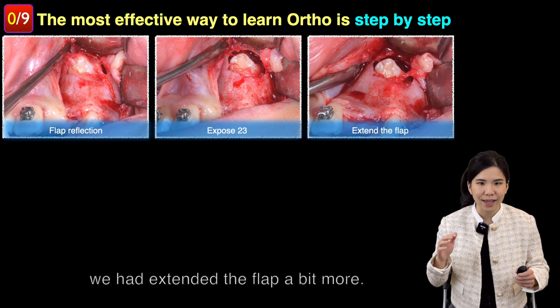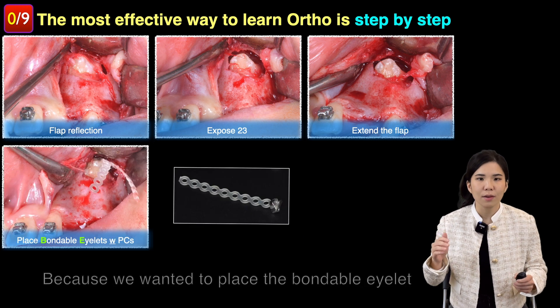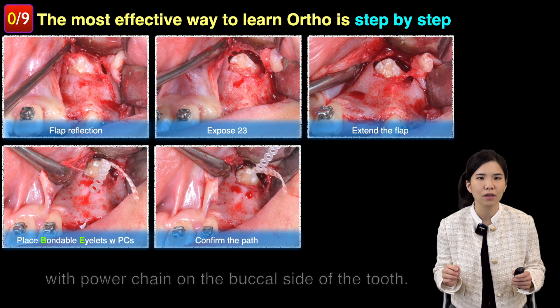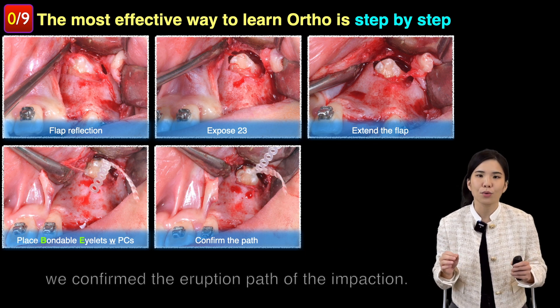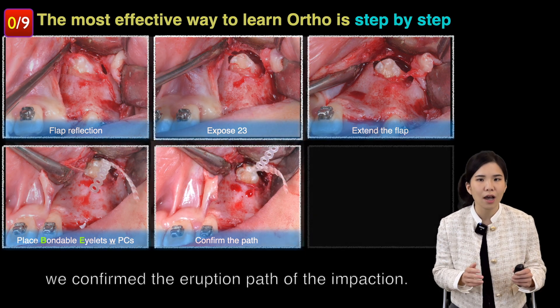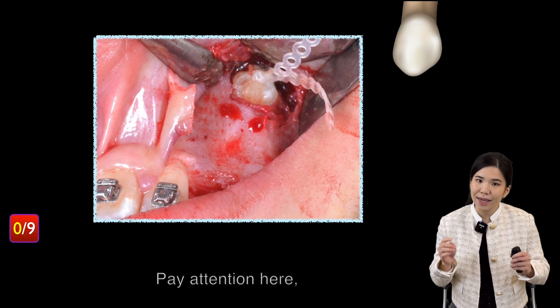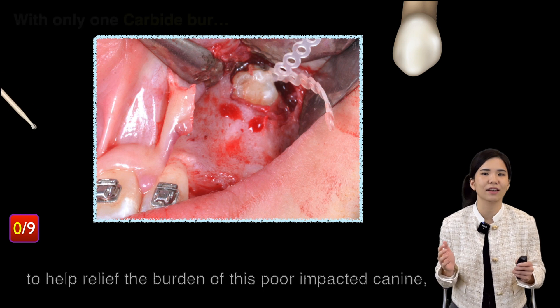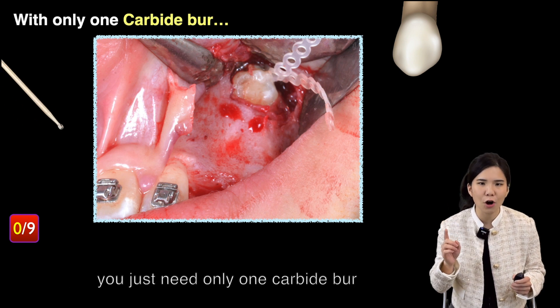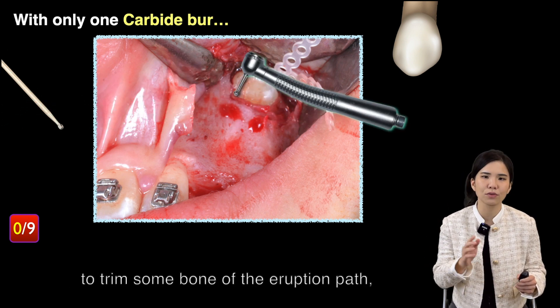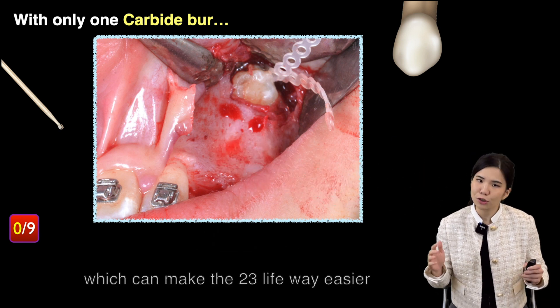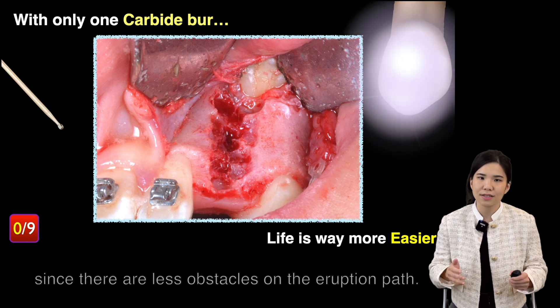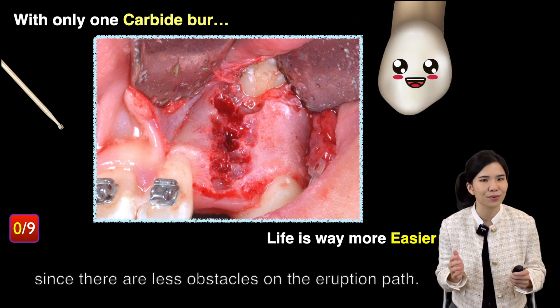Next, we extended the flap a bit more in order to place the bondable eyelet with power chain on the buccal side of the tooth. Once attached, we confirmed the eruption path of the impaction. To help relieve the burden on this impacted canine, you only need one carbide bur to trim some bone along the eruption path, which makes eruption easier and faster with fewer obstacles.